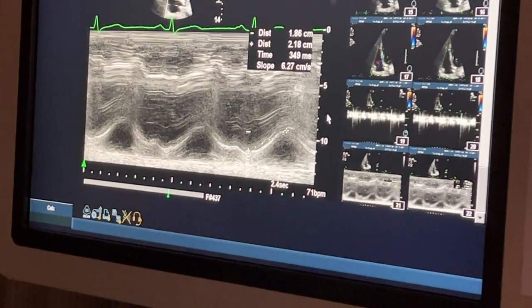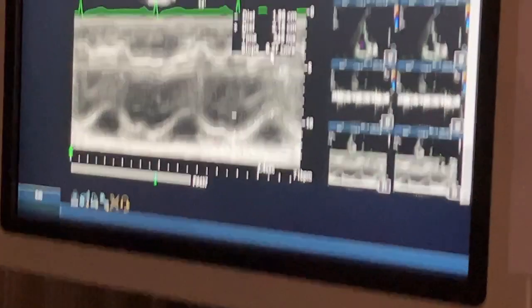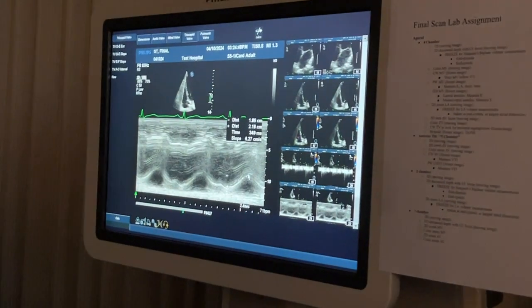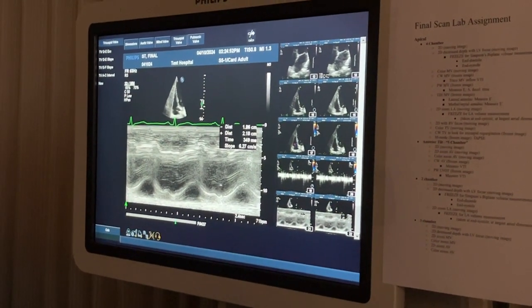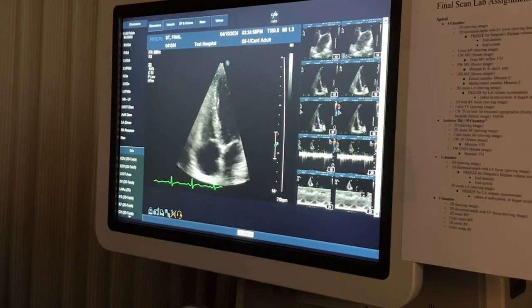What did you get that? I pressed time slope. I just wanted to show you where to put the points. I'm not sure that that's the best calculation because it's calculating time and slope rather than distance, but I wanted to show you where to put the points. I put the distance, yeah, but that was from my original measurement. Yeah. It's not really the best, but you should normally have an actual thing in your measurement package for that.